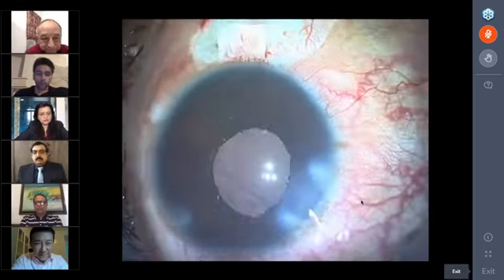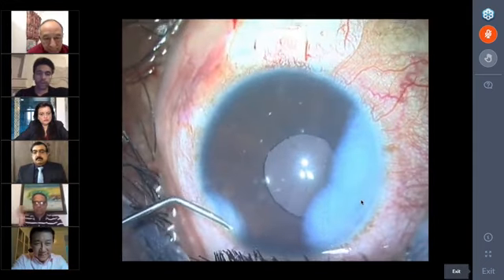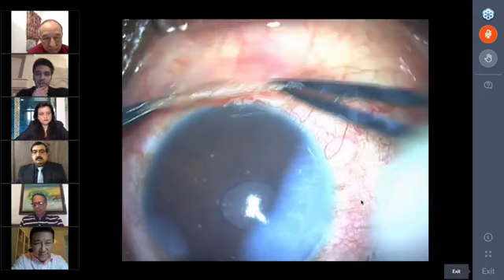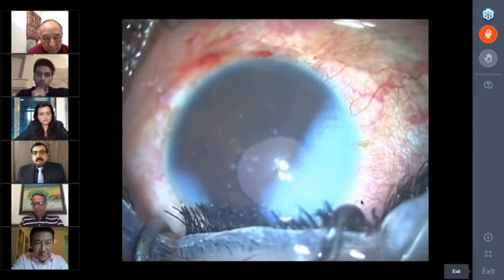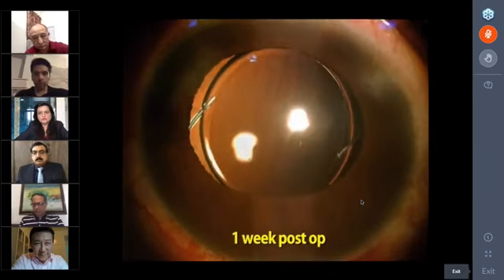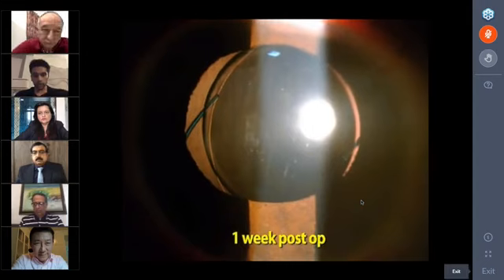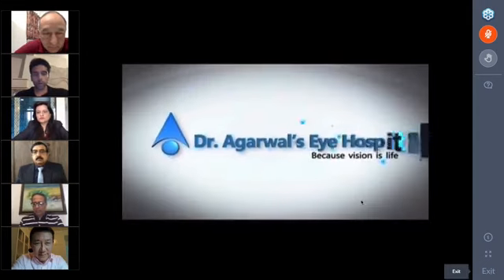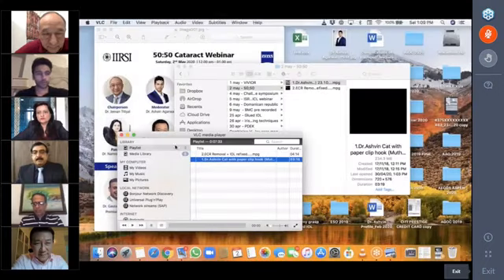So how this helped me is without any vitrectomy, without any sclerotomy, without any infusion or any sort of vitrectomy procedure, I was able to attain a central pupil, and this is the 1 week post-operative of the same patient. Wanted to show this case because I thought this is a complication which we all might face, and how do you come out of this in certain scenarios.